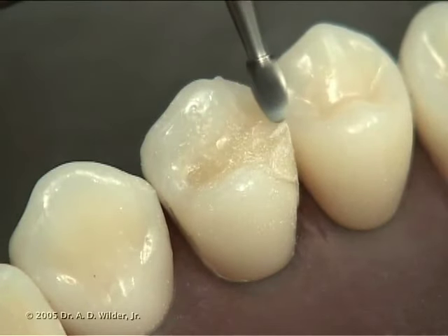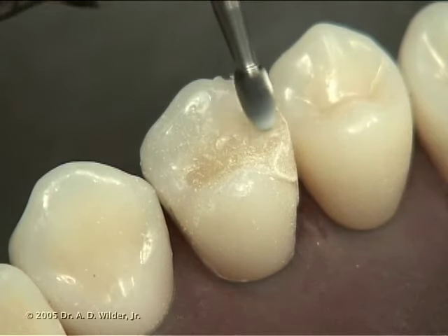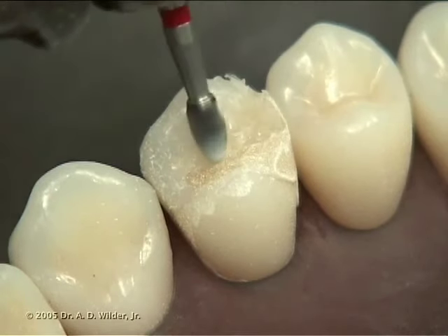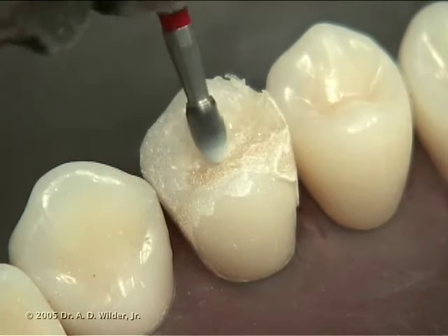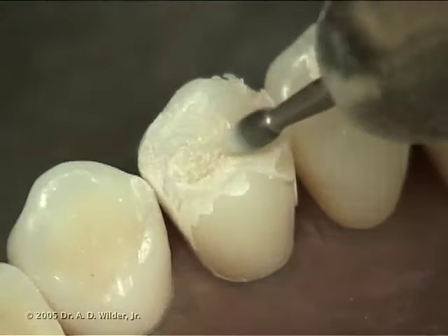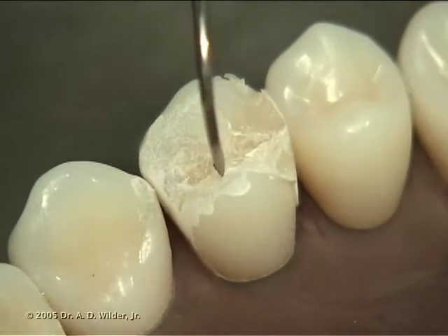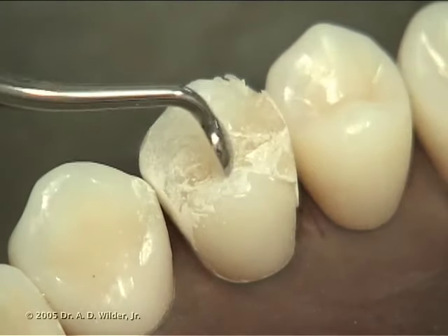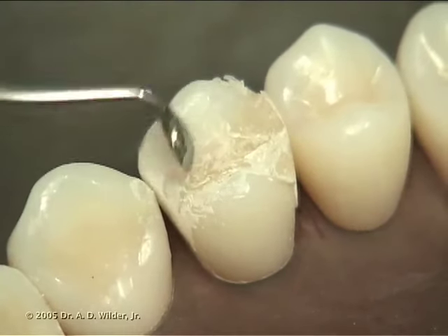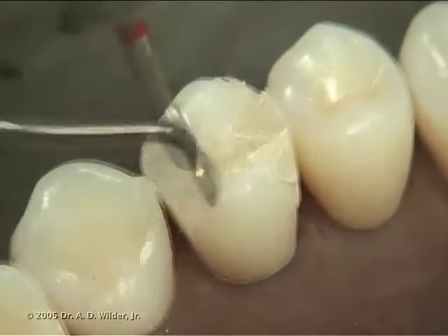You can contour the composite further with a round or football finishing burr to recreate the natural anatomy of the tooth. Light pressure and light strokes with the burr are best. You can check for flash with the tine of an explorer. You can remove flash with a finishing burr or manually with a cleoid discoid hand instrument used along the cavosurface margin.